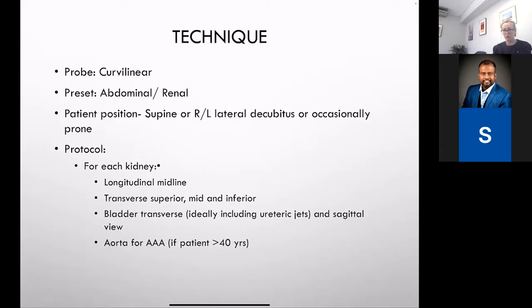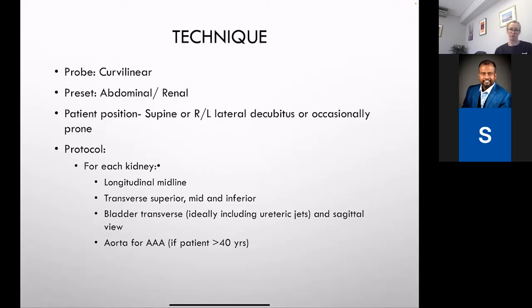For each kidney, you need a longitudinal view in the midline, then scan all the way from lateral to lateral on a longitudinal aspect. You also need to look for Doppler flow on the long axis, then turn the probe to transverse and go all the way from the superior to inferior pole. Some institutions recommend a video clip of the entire sweep; others prefer still images at superior, mid, and inferior. You can sweep a few times and take sample images. For the bladder, you need both transverse and sagittal views for volume measurements.